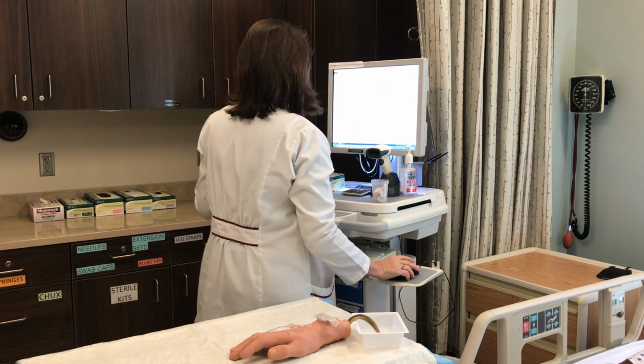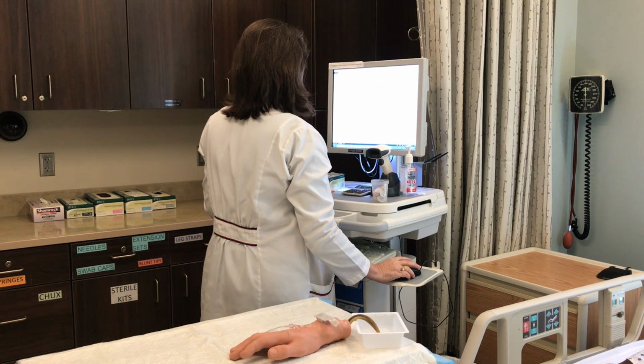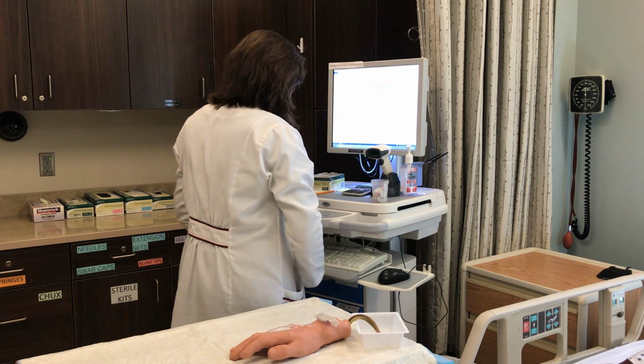Document IV push and normal saline flush administration on MAR, 6th right, scan badge.